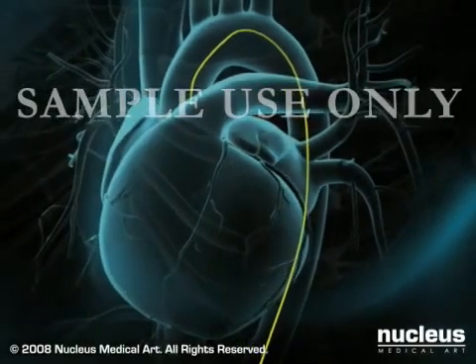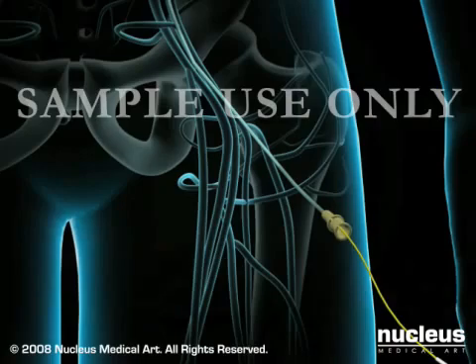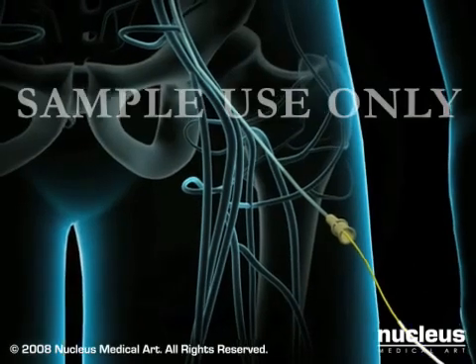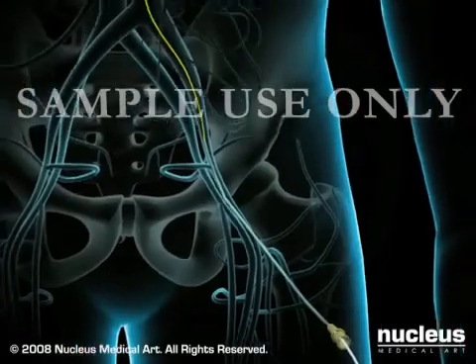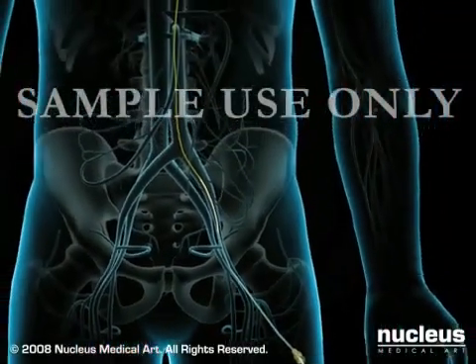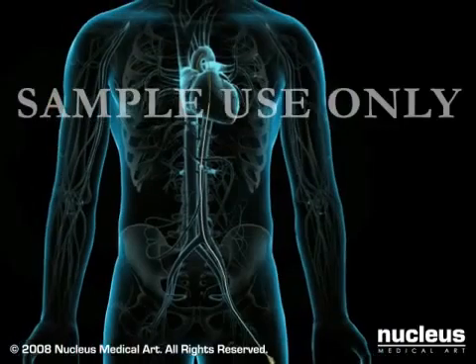The needle will be withdrawn and exchanged for a small flexible tube called a sheath that permits access to your femoral artery. Next, a soft, flexible catheter will be slipped over the wire through the sheath and threaded up to your heart. Your physician will watch the movement of the catheter on the fluoroscope.